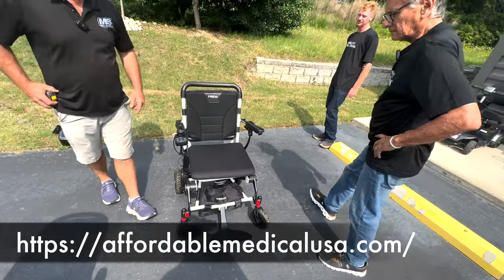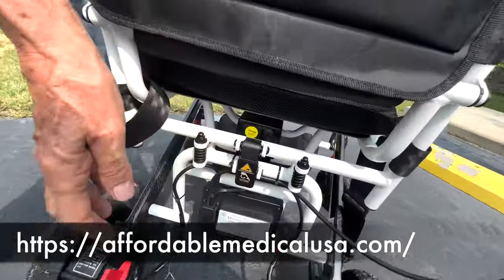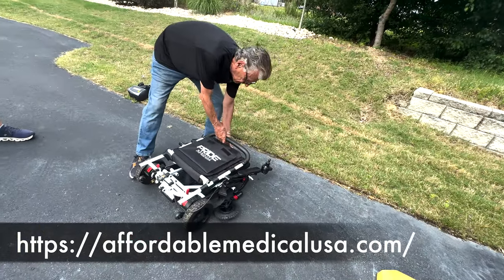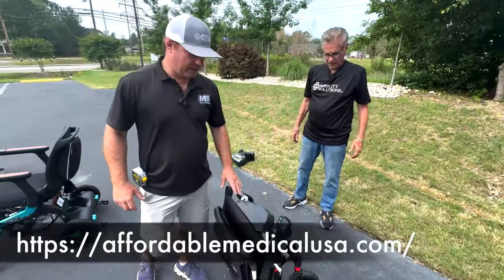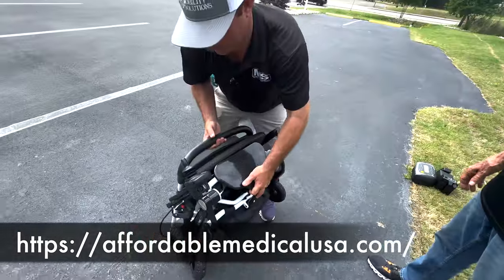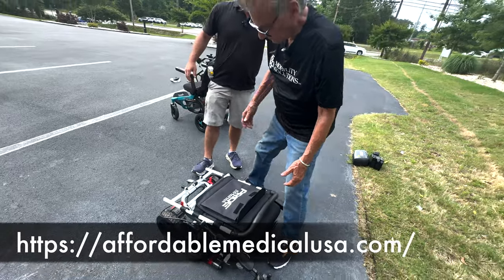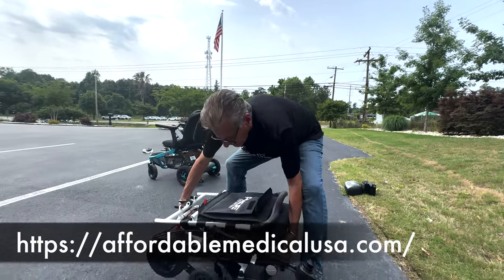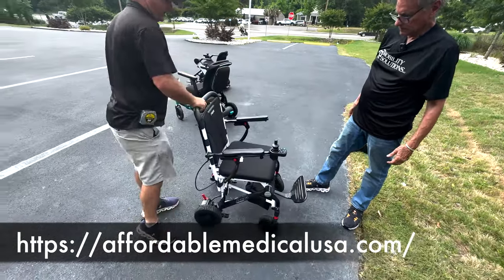Eddie, you know how to do this, don't you? Yeah. Okay, fold this down. This one has a little... Is that it? Yep. You can stand it up. As long as the caster wheels are in, you need to have the caster wheels out when you're riding in this. To pick this up, you can pick it up like this. Pick that up for me, Eddie. Tell me how it feels. Lighter? Yeah, much lighter. We know this is a light chair. To unfold it, grab it here, and kind of bring it back.